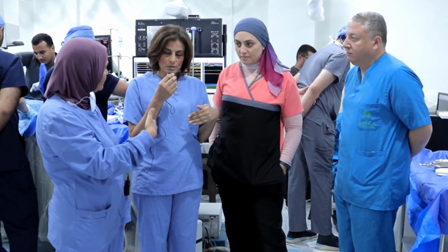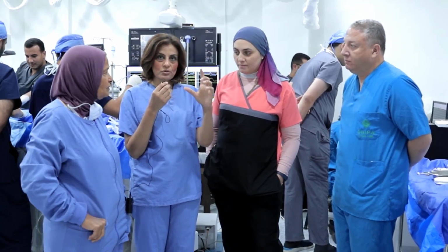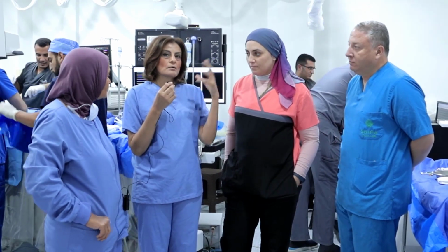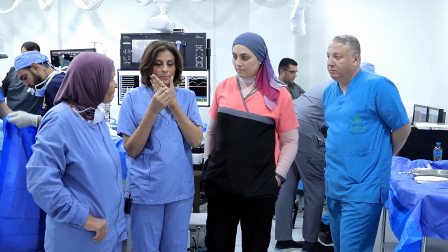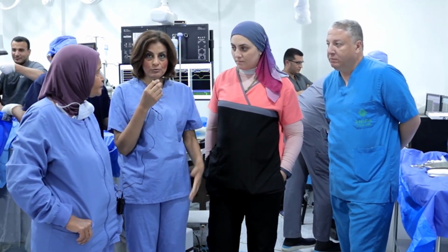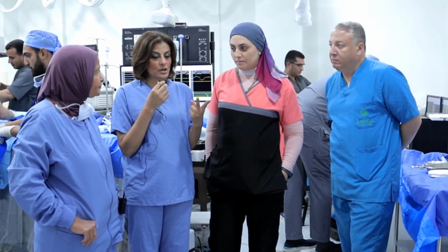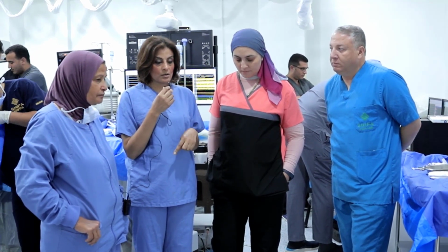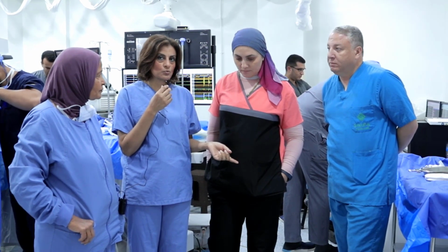Voltage map, substrate map. We found a posterior right atrial scar connecting the SVC with the IVC. There was a gap in the scar, but the tachycardia was not related to that scar. After the substrate map, we tried to induce the atrial tachycardia with isoprenaline infusion. It was non-sustained. There were two types of tachycardia, one faster than the other. One was 2-to-1 conduction and the other one was 1-to-1.